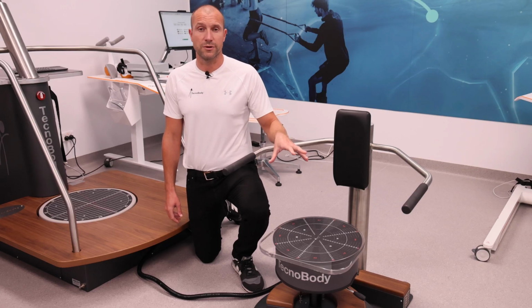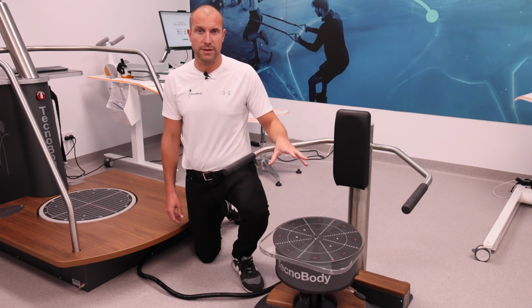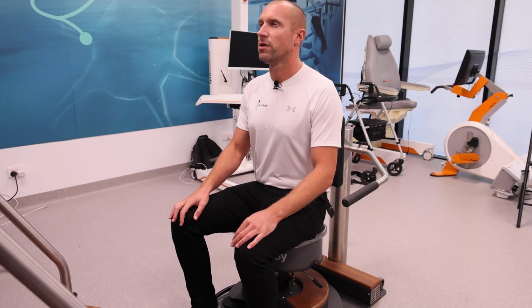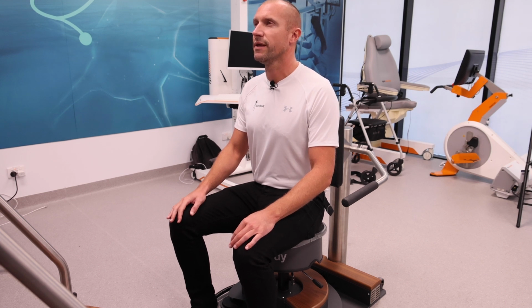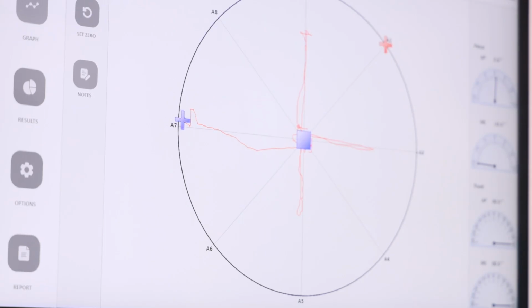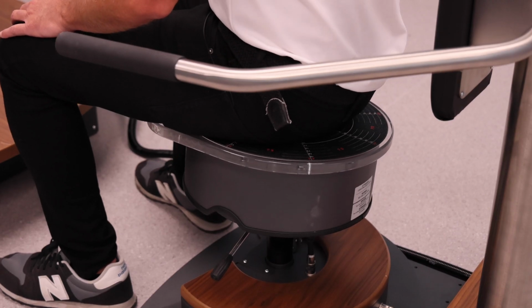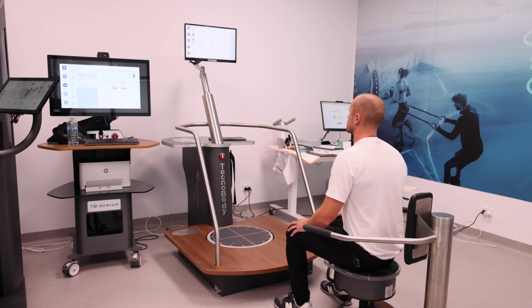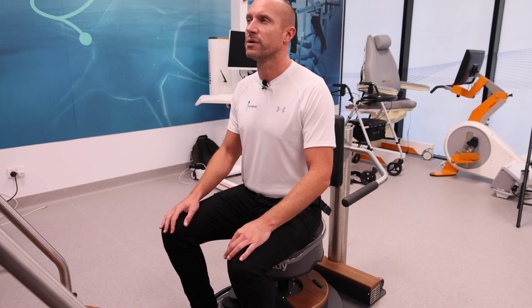We're now going through the third module of the ProKin that is represented by the trunk module. The aim of the STAR test is to investigate the mobility and the control of the pelvis. So the software will display a blue cross and directions of movement which the patient will try to follow and to have the best in terms of mobility. According to the total movement, we will get the final results.